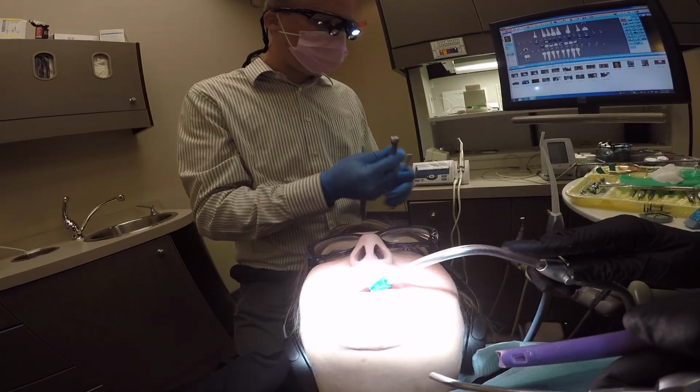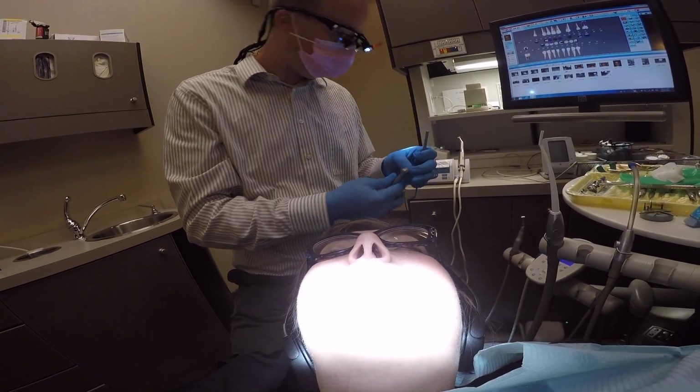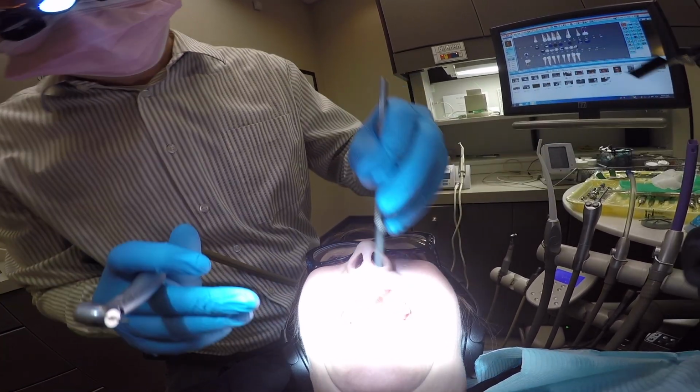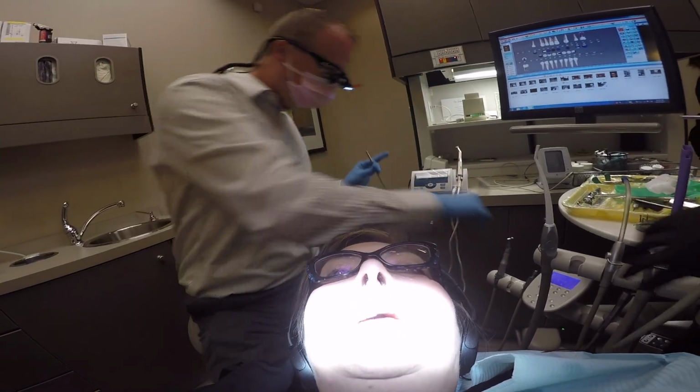How does it feel when you bite down? Feel normal? Yeah. Okay. Okay, get you to bite down again. Perfect. Okay, and everything feels normal with your partial in? Yeah. Okay, let me do the final polish. Okay.